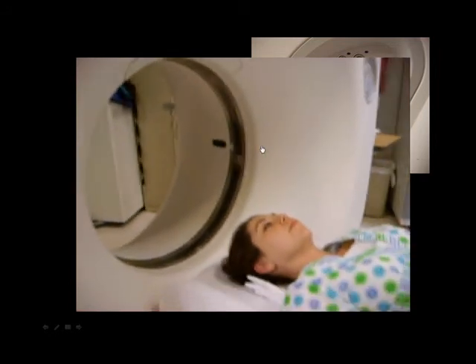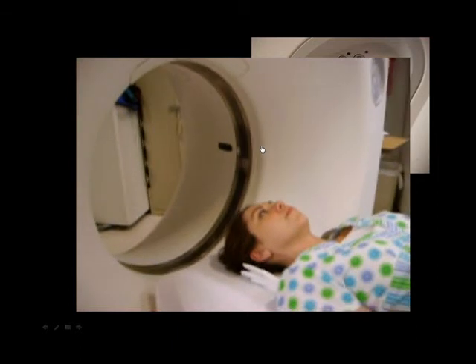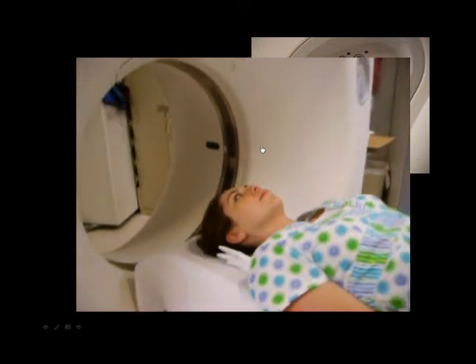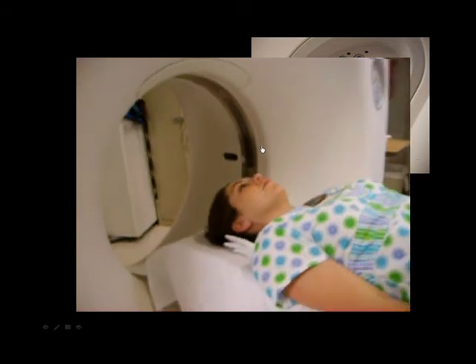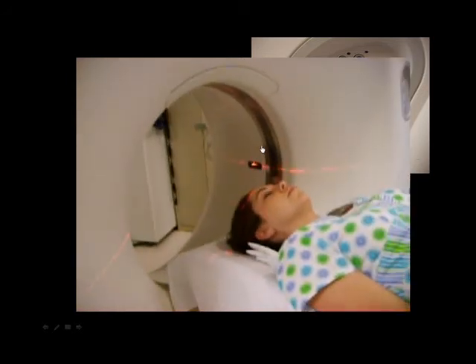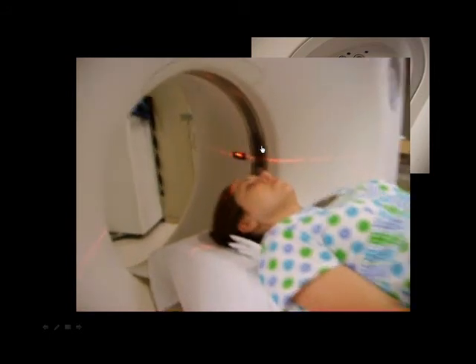But this time when you position the patient, instead of using the orbital meatal line, you're going to use the sternal notch. So the patient goes a little bit further into the gantry. You're still centering on the mid-sagittal plane, and you're still centering right around the EAM coronally. And let's take a look at that.